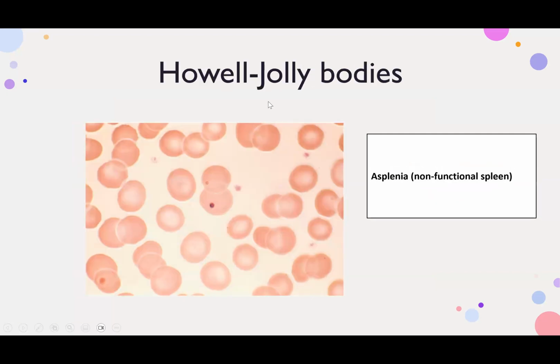Okay, now Howell-Jolly bodies, it suggests that you have asplenia, non-functional spleen, or hyposplenism. These are the Howell-Jolly bodies. Okay.